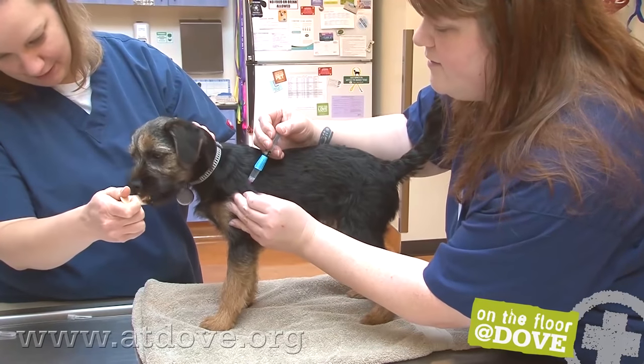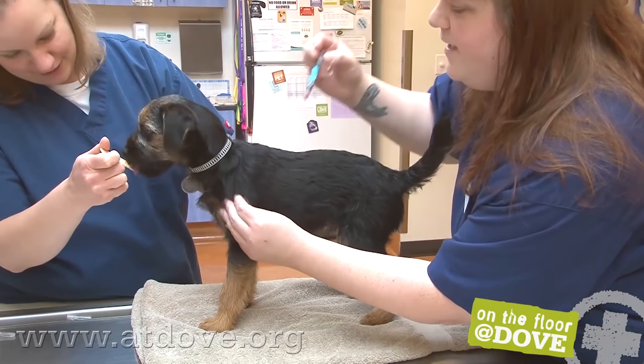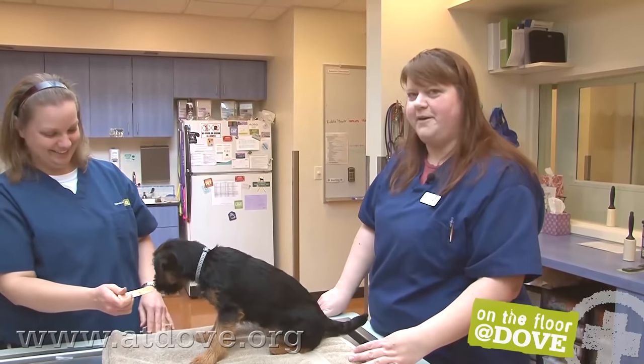He might cry because this is the stingy one, or he's going to be super brave — and he was so brave! And that's Bordetella and DAP in a puppy.